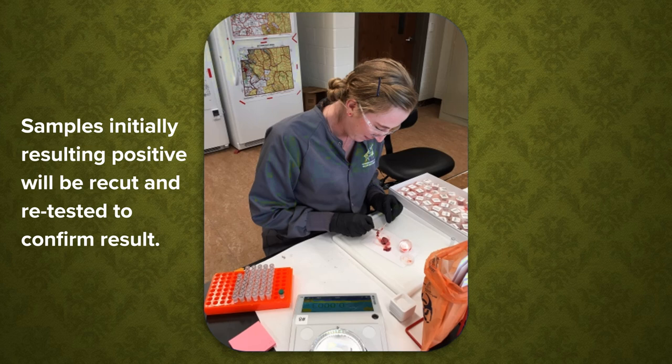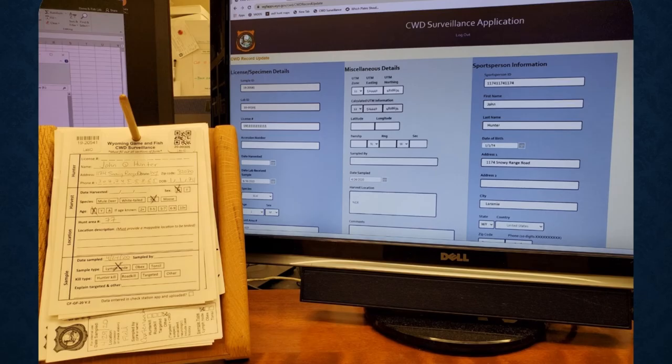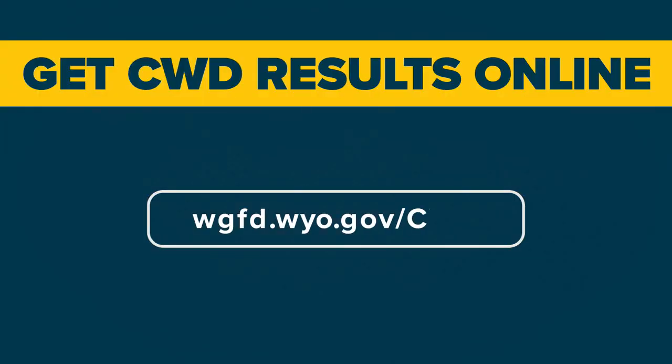Samples initially resulting positive are recut and retested to confirm the result. Samples initially testing negative are released. Finally, sample tag info and result data is entered into the Wyoming Game and Fish Chronic Wasting Disease web app. Go online to the Wyoming Game and Fish Department website to get your results.